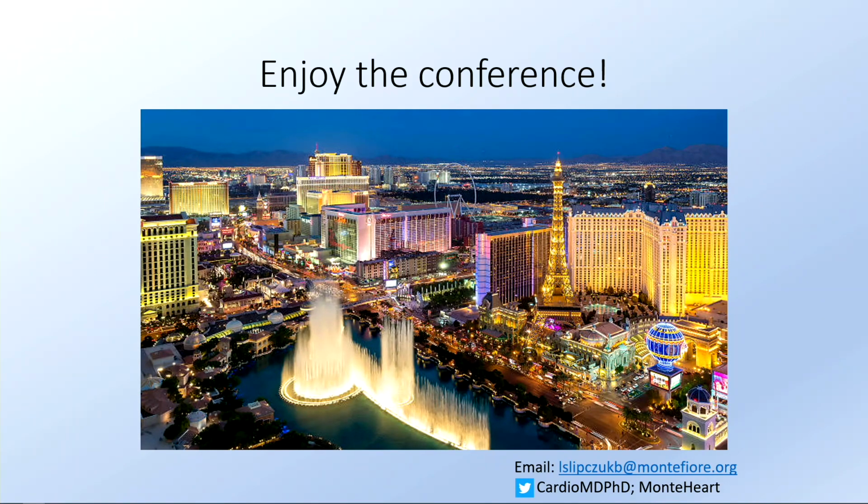Okay, thank you. You mentioned salvaging suboptimal quality exams with those different types of reconstruction. So how does it impact the reduction of rescans in your practice? Yeah, I think this is very important. For example, if you're going to be doing triple rule-outs, then it's extremely important because the radiation on these scans is high. So even if you're scanning just the heart afterwards, you don't want to give any more radiation. So we try not to do too much of the triple or quadruple rule-outs, but if it's going to get you to the answer, sometimes you have to do it, but you definitely want a diagnostic scan.